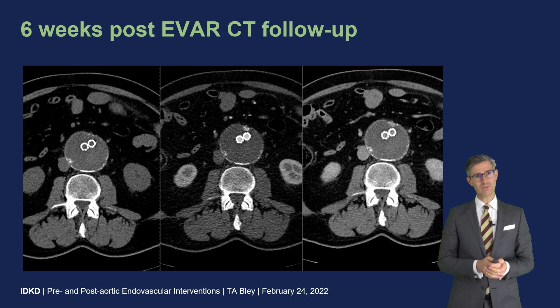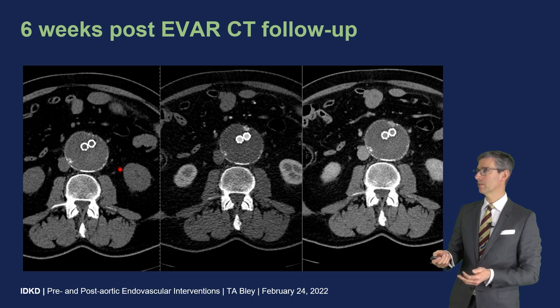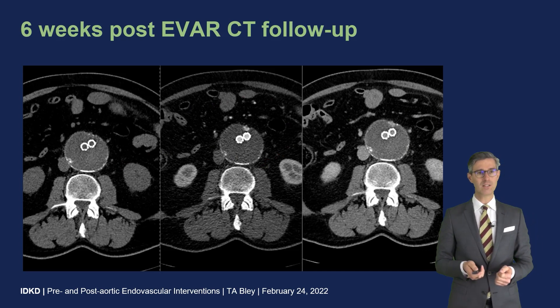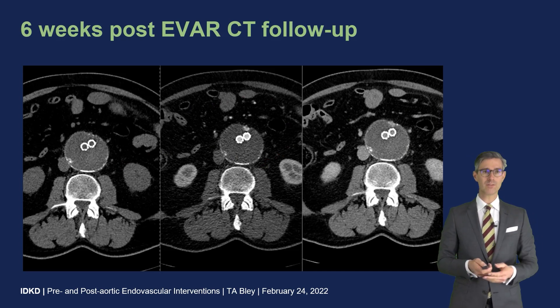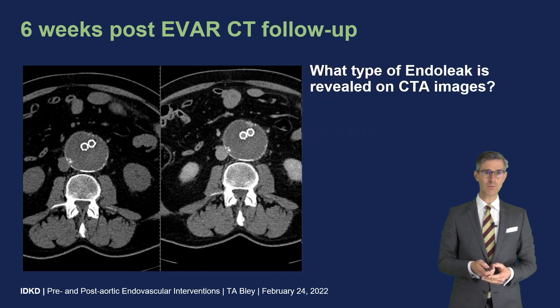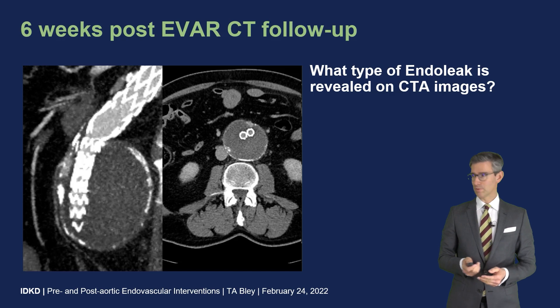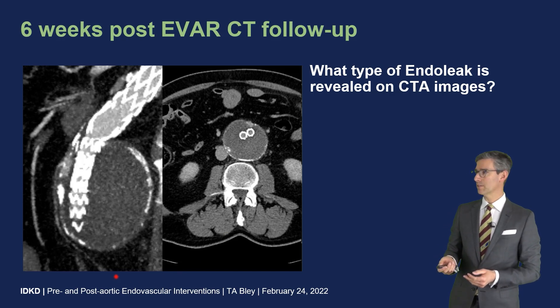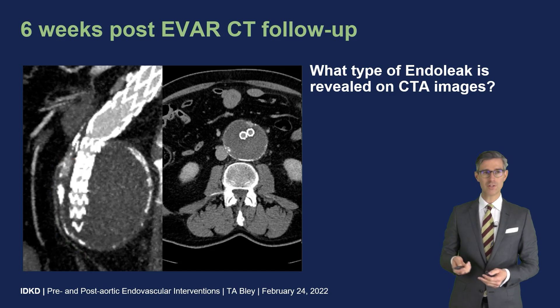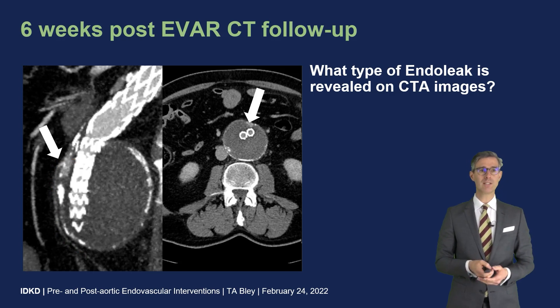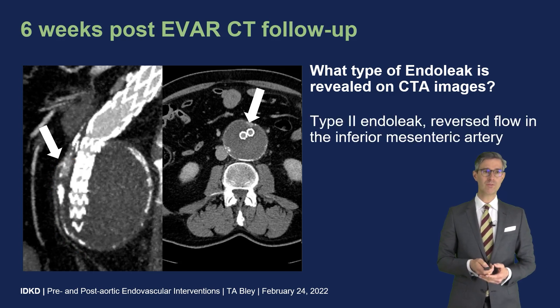In our case, at six weeks post-EVAR, you see here a non-contrast, arterial phase, and later-phase contrast-enhanced CT scan, and you can probably readily see the endoleak. This is the sagittal reformat, and you can see the inferior mesenteric artery coming all the way to its origin. This is a type II endoleak due to reverse flow of the inferior mesenteric artery.